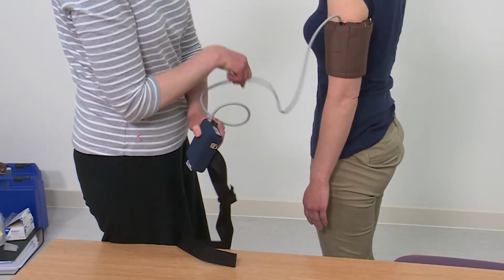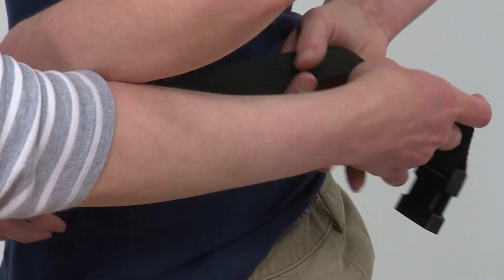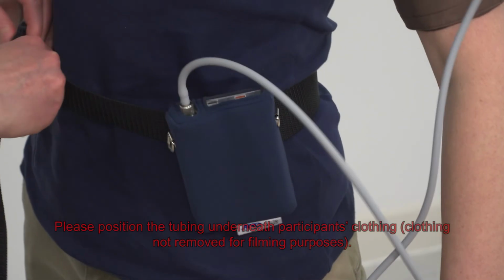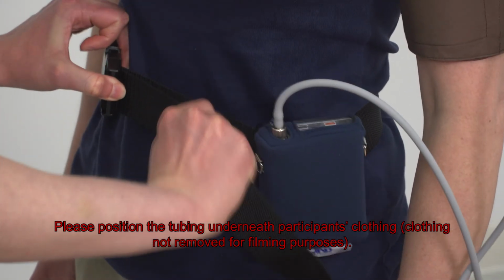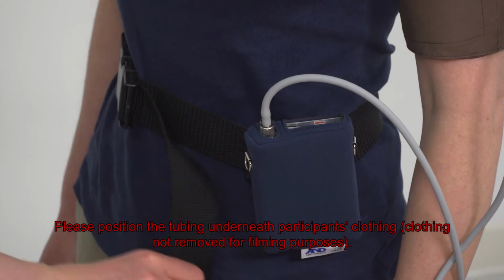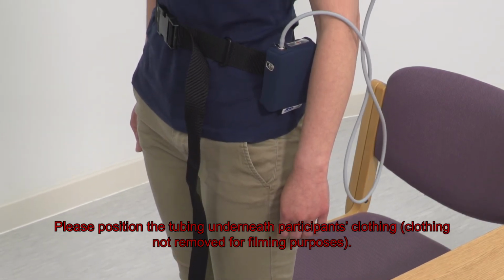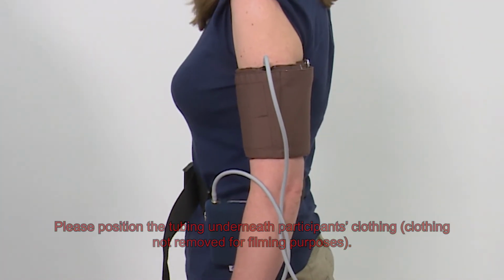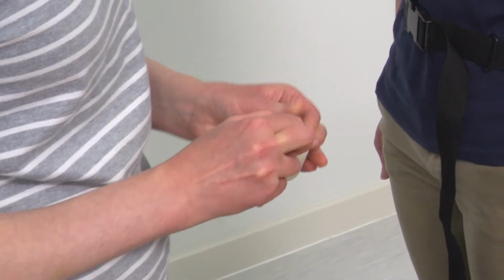Instruct the patient to turn the monitor off by pressing and holding the black Auto On-Off button for approximately 3 seconds when driving. This may not apply to all patients. Also turn it off if there is excessive arm pain, and at the end of 24 hours when they can remove the monitor. Use the belt and carry case to keep the recorder around the patient's waist. This can be removed for sleeping and dressing as necessary.